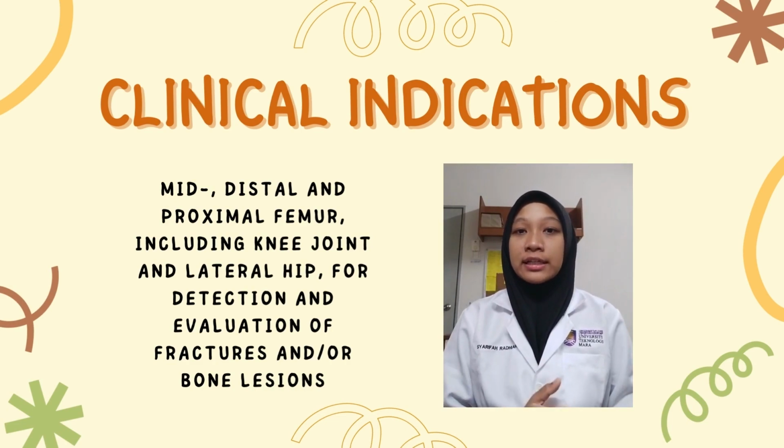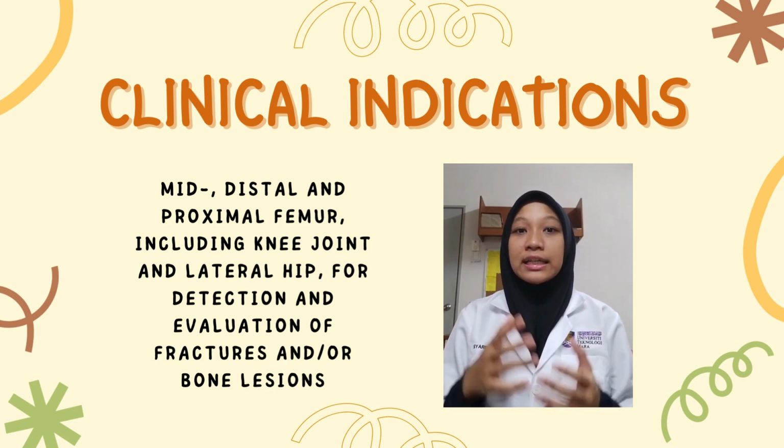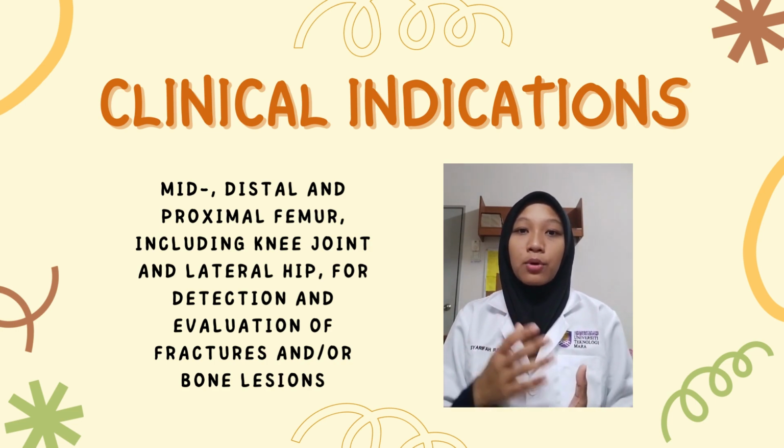Next, as for the clinical indication of lateral femur, we must include the mid, distal and proximal femur, including knee joint and lateral hip, for detection and evaluation of fractures and or bone lesion.